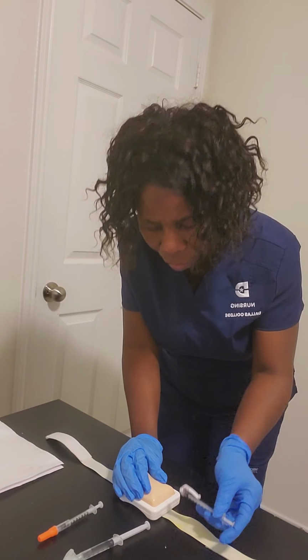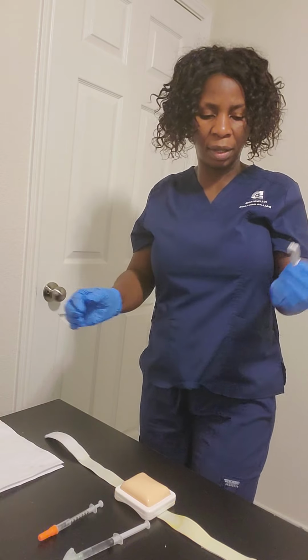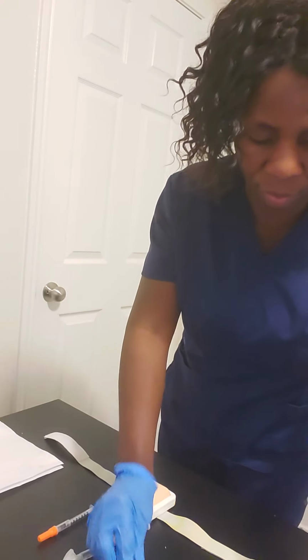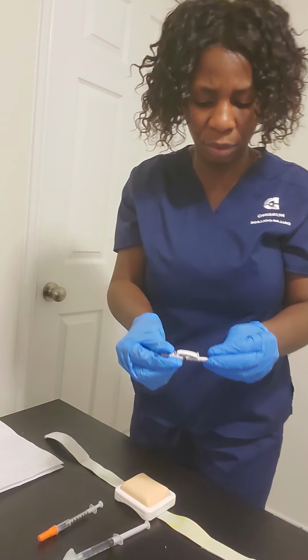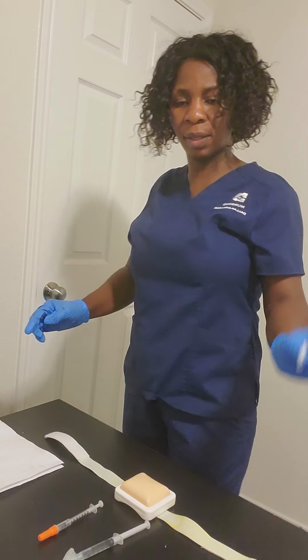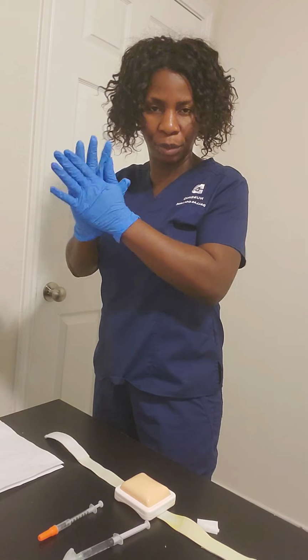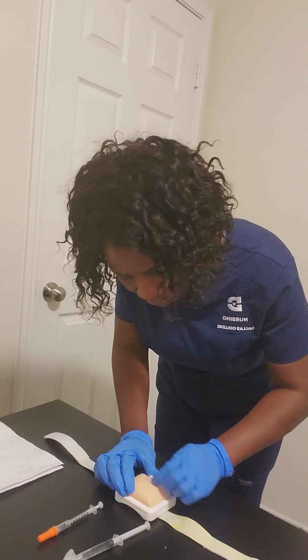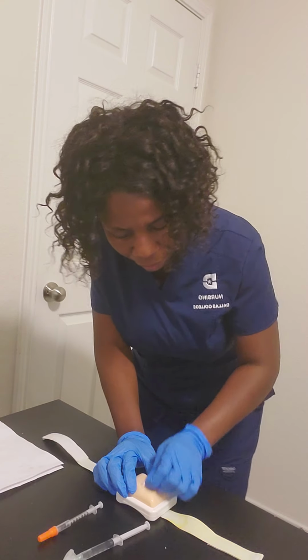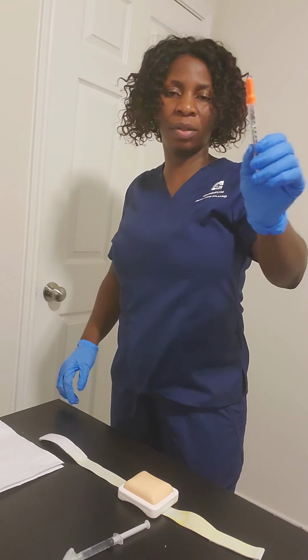So I've been able to go within 5 to 15 degrees into the skin, and the needle was visible while I was administering the injection. I'll be able to administer the PPD, and I'm going to cover this and put this in the sharps container. The next thing is I'm going to perform hand hygiene again, and put on a new glove. So I'm going to clean the residual area in a circular form. Then I'll be going to the next injection, which is going to be my subcutaneous injection.